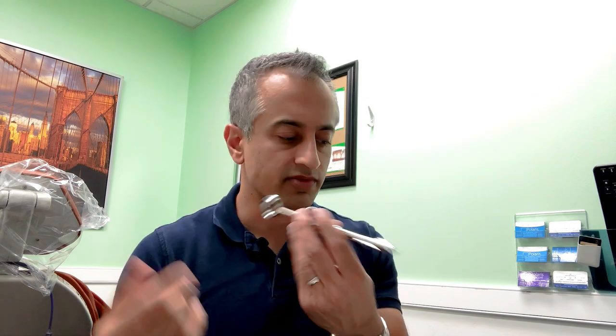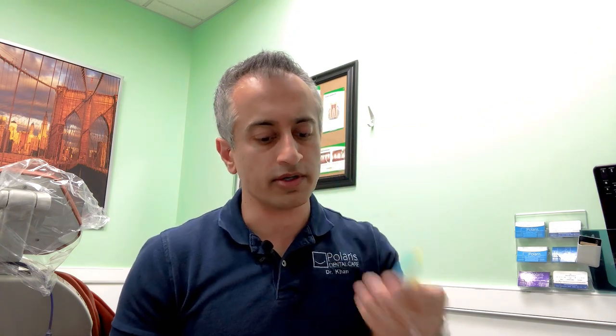So let's start with how to load one of these cartridges. Here we have an aspirating syringe, a Cook-Waite design from Benco, and we have two different types of needles: a blue short needle and a yellow long needle. They both work exactly the same when it comes to assembling a cartridge.